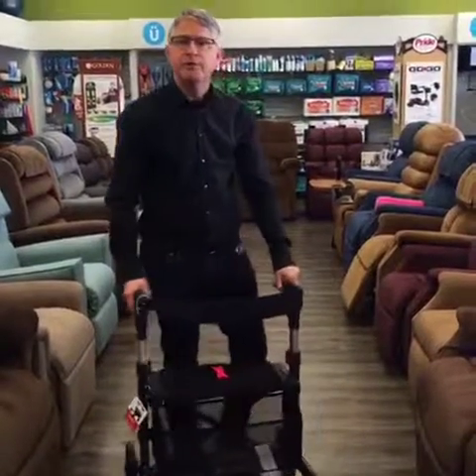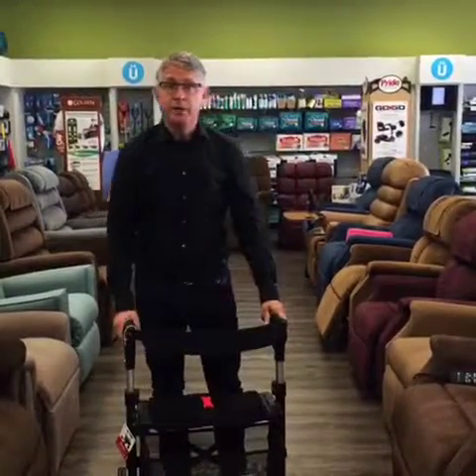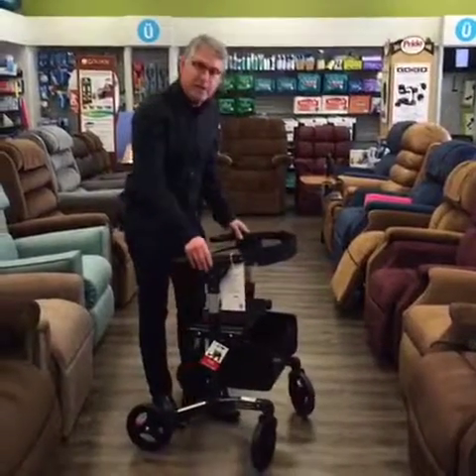It comes in three different sizes: 19 inch, 21 inch, and 24 inches off the ground, to accommodate different sized people. What's really great about this rollator is it's also lightweight.